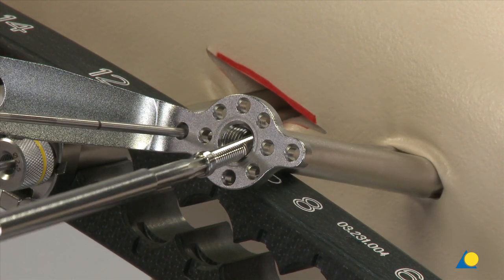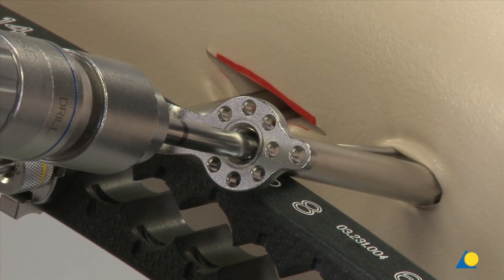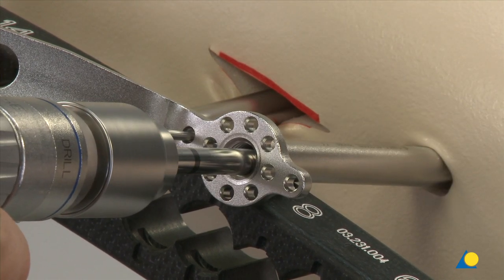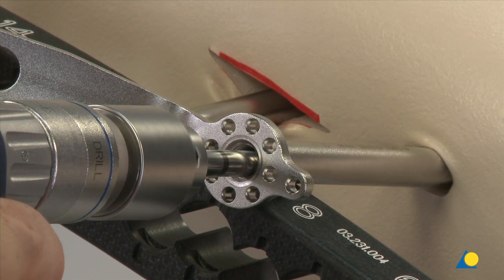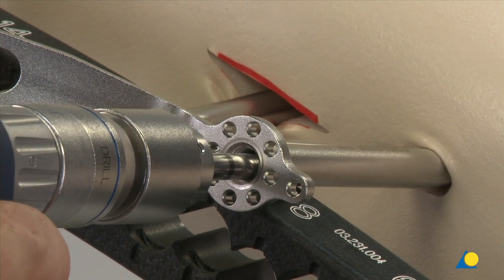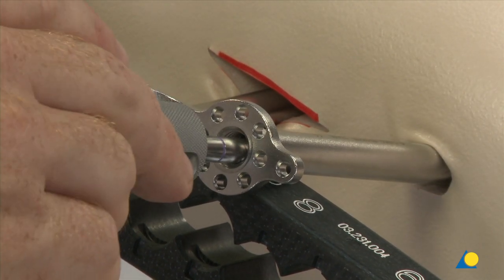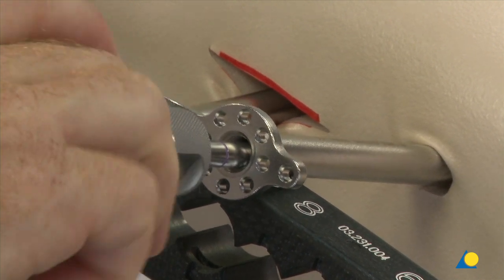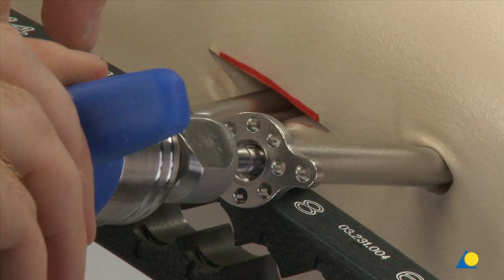Insert the appropriate 5.0 mm variable angle locking screw through the protection sleeve. Control the position of the screw under image intensification before final tightening. Final tightening must be done by hand using the T25 star-drive screwdriver shaft and the T-handle with torque limiting function 6 Nm.